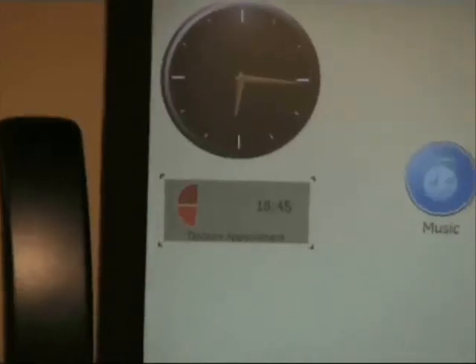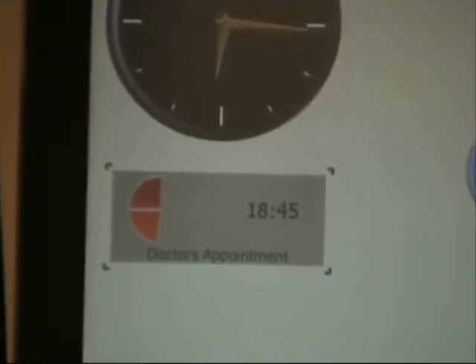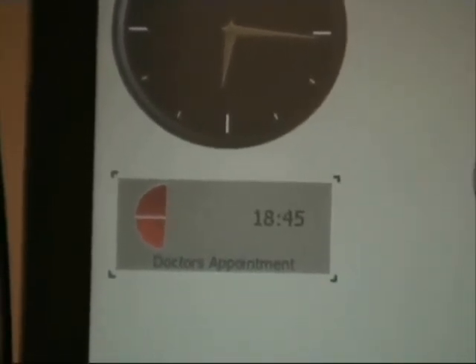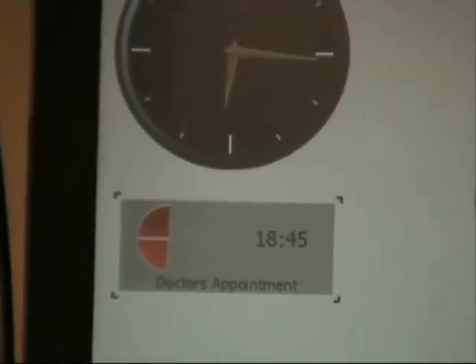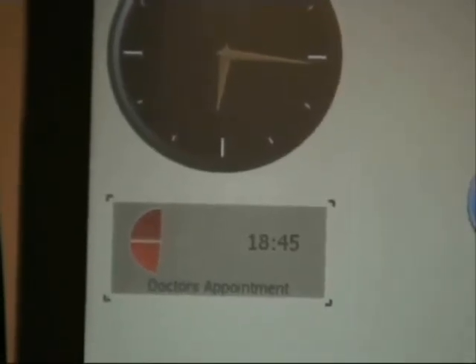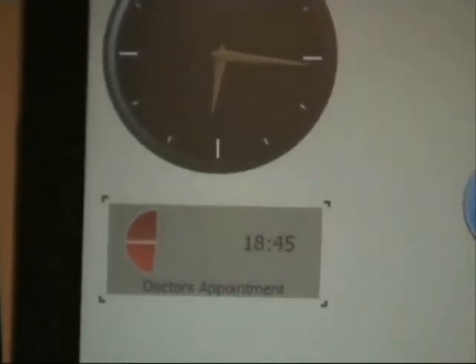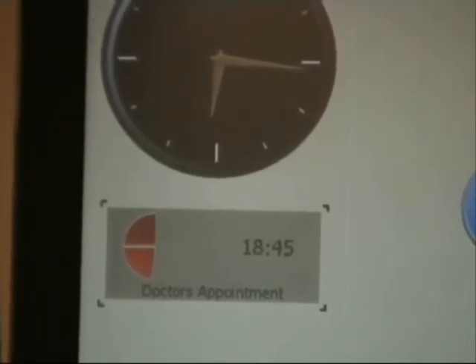Also, as part of that, you can see that now the quarter-hour clock has just got 1 item left because the other reminder has fired and has moved the doctor's appointment into the primary position as it is the next reminder. Again, you can see that this is more colourful and prominent now, and that we have just under half an hour left to go before the next reminder.